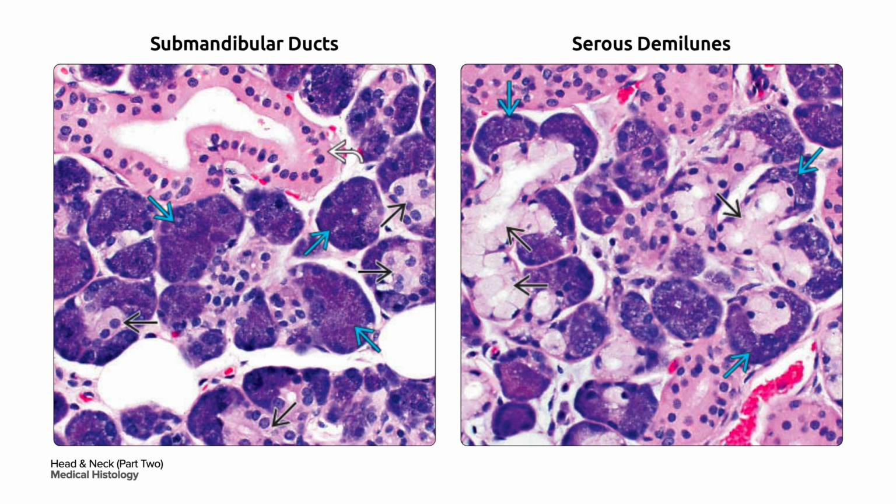On your left is a submandibular gland, which is a mixed gland predominantly composed of your serous acini in single blue arrow, but also containing a minor mucus acinar component. Striated ducts in a curved white arrow are longest in the submandibular gland and are easily recognizable. Intercalated ducts in a single black arrow are shorter than in the parotid gland, but are easily seen.